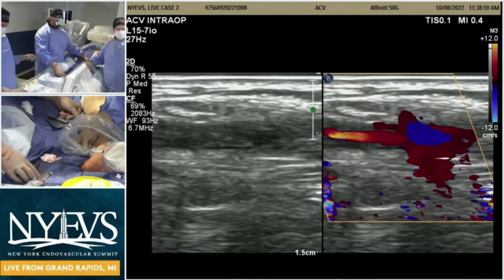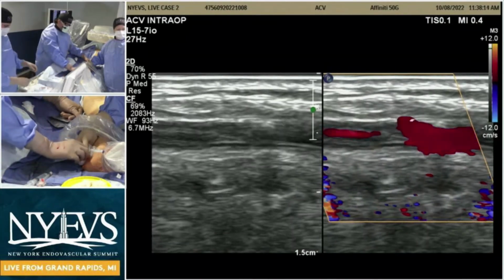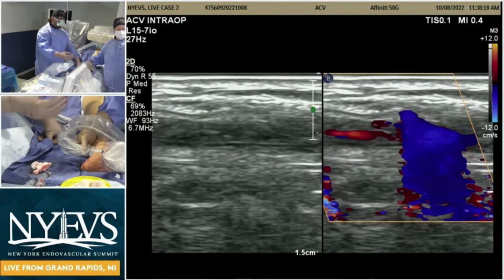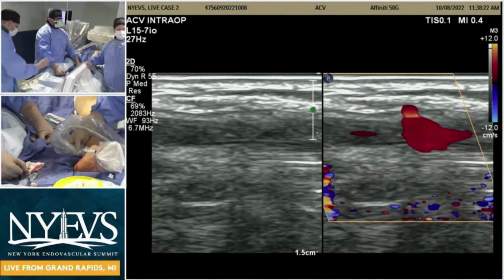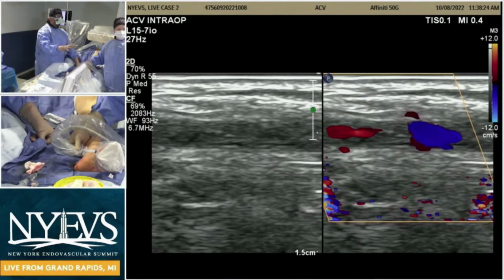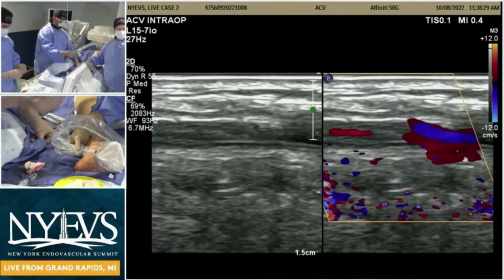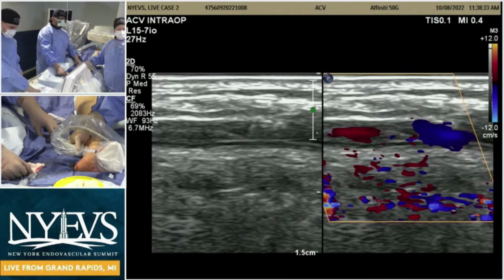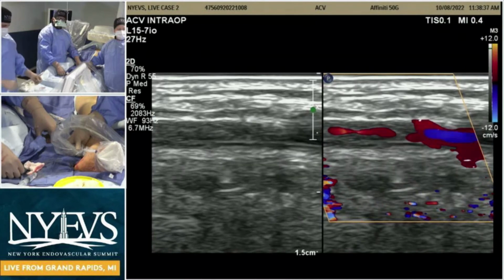And Abby's going to apply the hockey stick probe. She's going to apply enough pressure, allowing antegrade blood flow to the plantar circulation without bleeding in the subcutaneous tissue. So that's how we close our TAMI technique patients, making sure that there is patent flow or patent hemostasis beyond our access point. So with that, I'm going to shut up now, PK. I'll turn it back to you.